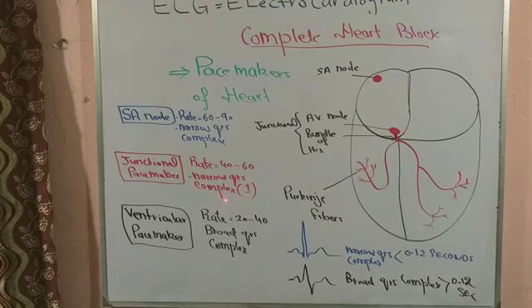From where will come the narrow QRS complexes? From the ventricular depolarization. Why do we say in majority of the cases? Because when the block is at the level of the AV node and its upper portion, they are narrow. But in those cases where the block is even involving the bundle of His, the QRS complexes will be broader. So broader QRS complexes are the ones which are longer than 3 small boxes in duration or longer than 0.12 second. This is an important concept. So junctional pacemaker is located here and it's dormant normally, and we will talk about its dormancy in a minute.